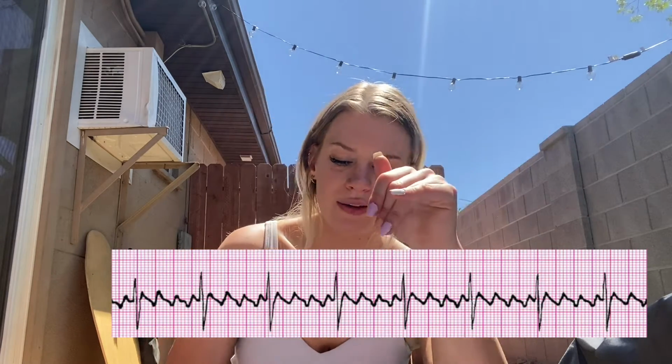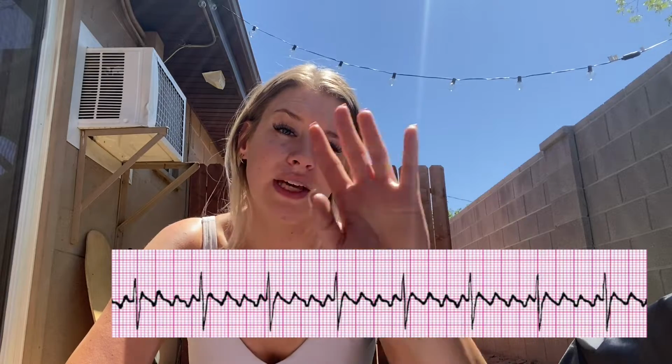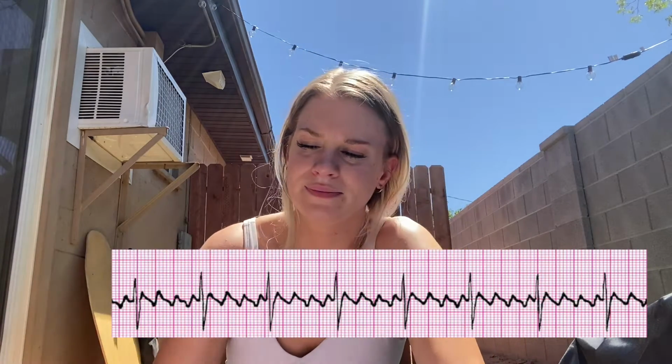Anticoags, antiarrhythmics, that's amiodarone and digoxin. Amiodarone is preferred over digoxin because digoxin is toxic, and it takes time to build up a level of digoxin. And so you have to count the QRSs and the waves, because there's no P waves or T waves, it's literally just waves. So you have to figure out what the ratio is. All you do is count it, literally, that's it. But you have to figure it out still. And document it, duh. Alrighty, let's go over first degree AV blocks.